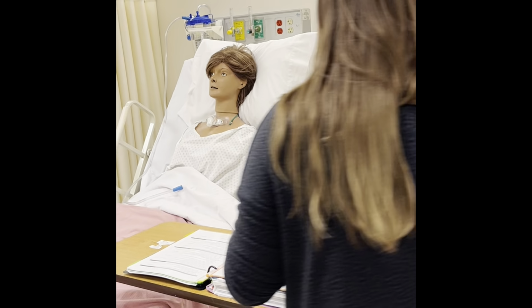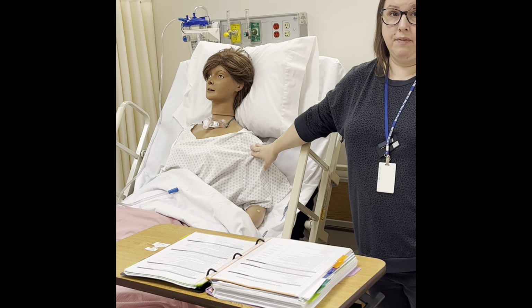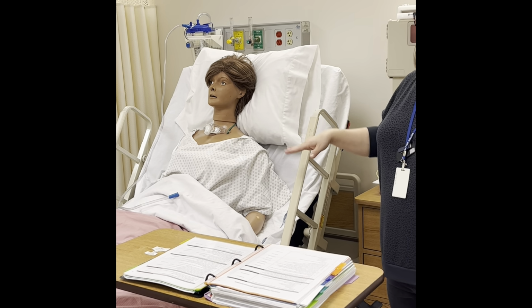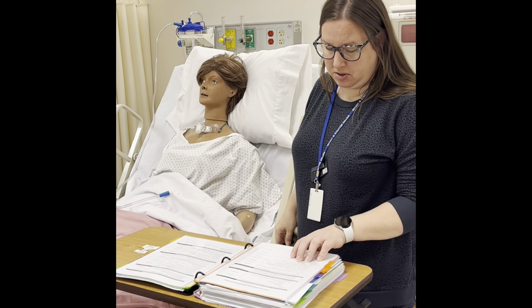Then we want to make sure they're in high Fowlers. I already have her in high Fowlers. I would make sure my patient is in high Fowlers. This bed is a to-do, so just leave her this way. That's why I had it for my students yesterday.